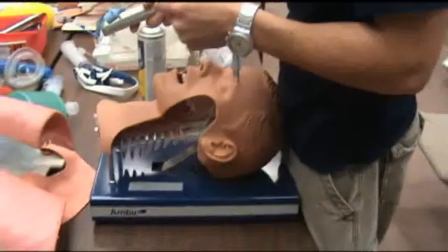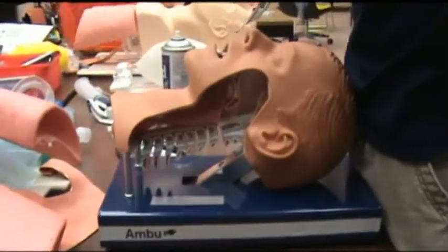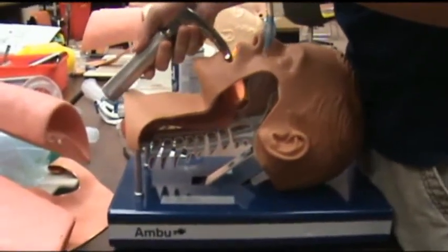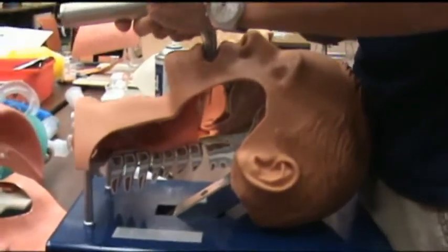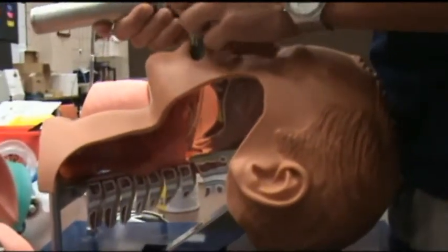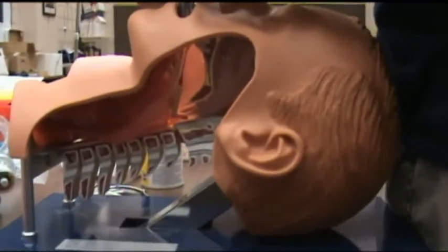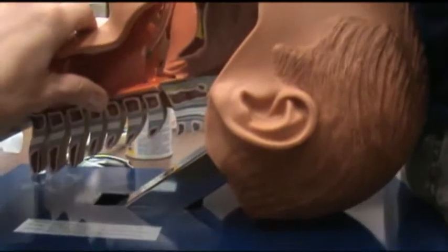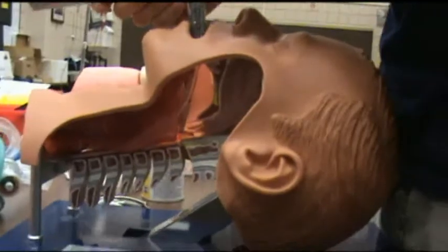This is a side-angle view of endotracheal intubation using the Macintosh No. 3 blade, which is curved. The Miller is a straight blade that lifts the epiglottis directly, whereas the Macintosh is inserted into the space before the epiglottis called the vallecula, and the curve of the blade exposes the glottic opening and the vocal cords. From this angle you can see the esophagus, where the tube should not be placed. Correct placement of the tube is between the vocal cords.